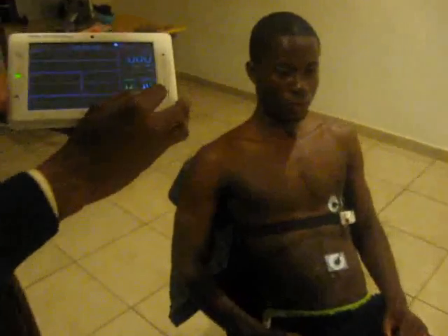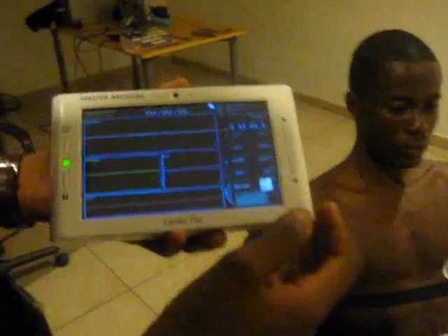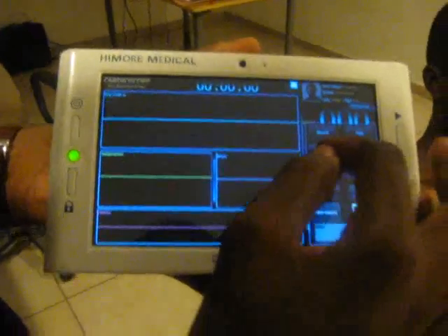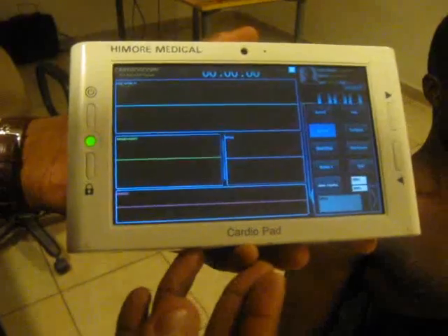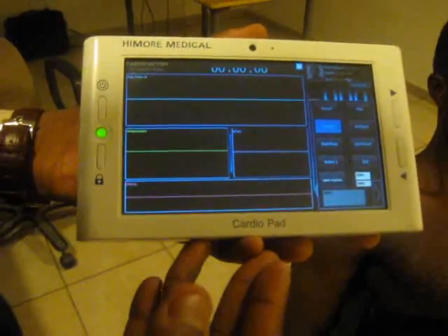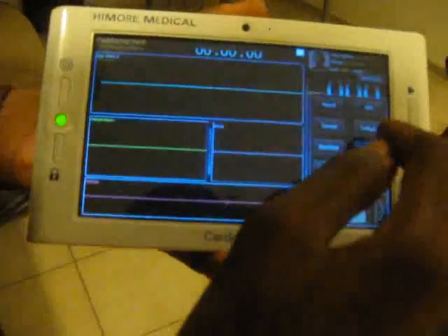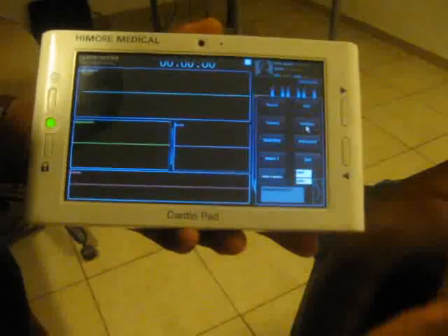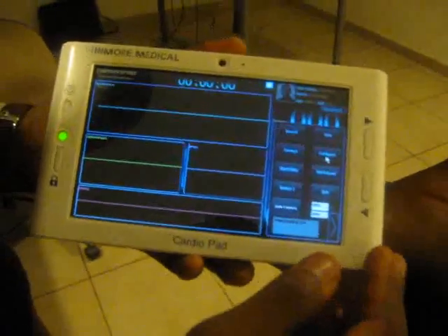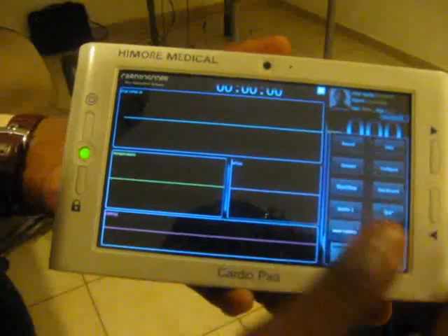Then we will make a connection between the device and the patient. To do that, we will just press a button. After the wireless connection has been established between the device and the patient, we will start the recording.